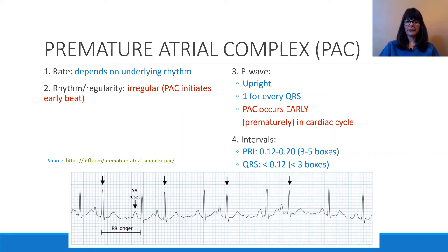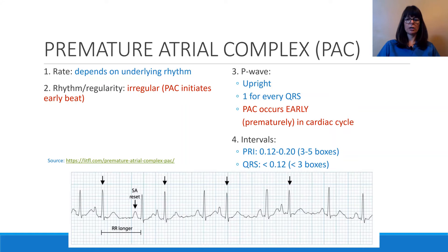Looking at this example rhythm strip, we can look at the rate first. Counting 1, 2, 3, 4, 5, 6, 7, 8, 9, 10 QRSs gives us a heart rate of 100. We can already see that the rhythm is pretty irregular. Even without calipers or EKG paper, we can see that the distance between some beats is longer than between others.